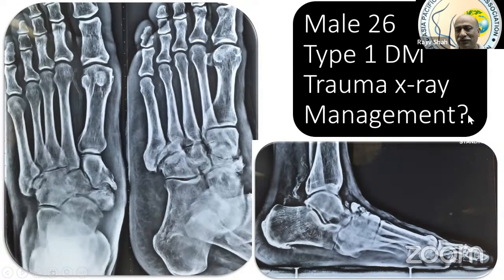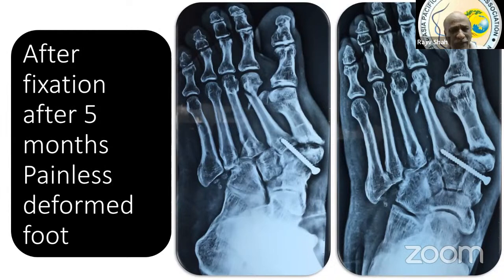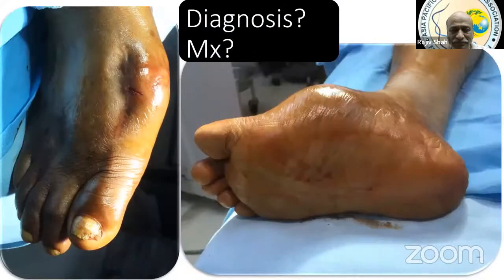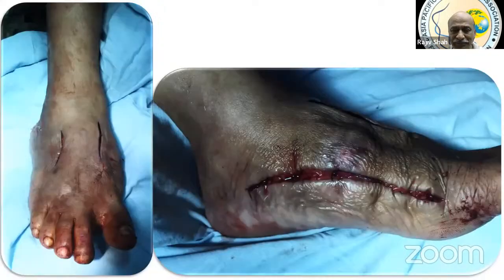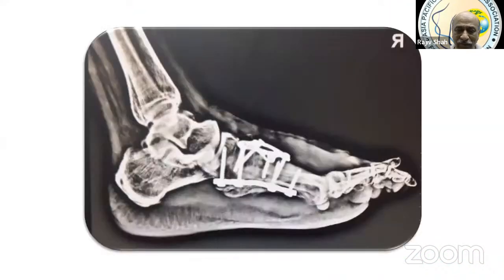This is something which should give you suspicion: type 1 diabetes mellitus, trauma, and came to you with these X-rays. So the surgeon went in and fixed so many things, K-wires and all this. And it was after 5 months that this patient came to us walking with a painless, deformed foot, a rocker bottom kind of foot. And this is where the plano valgus kind of midfoot deformity was treated with a plantar plate and corrective midfoot fusion. And this is how the Charcot foot was reconstructed and the arch was reconstructed.